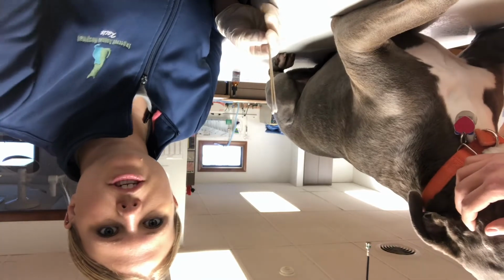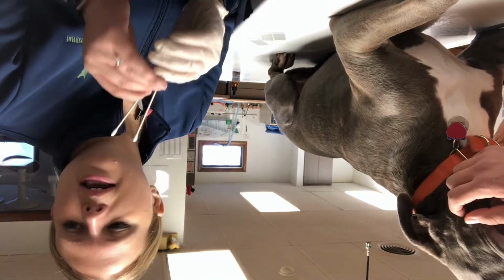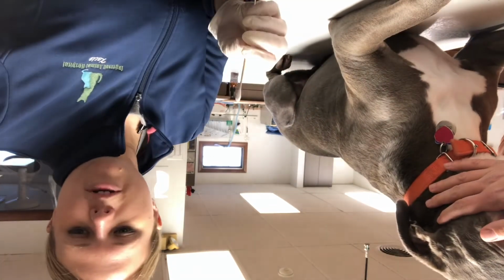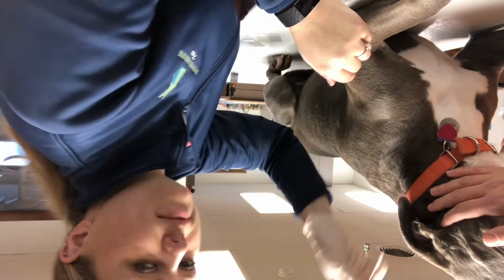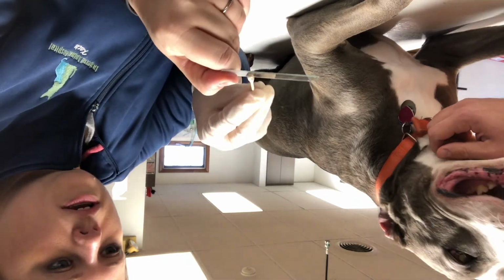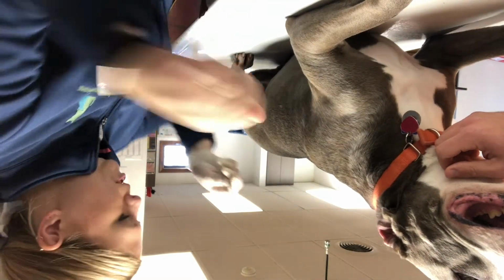For an ear cytology, we are inserting our cotton tip swabs into the ear canal in order to identify the source of an ear infection. I'm going to insert one of my swabs down into the ear canal. And do a spin and a good wipe out. And then I'm going to do a roll onto my microscope slide. And then I'm also going to do another one.